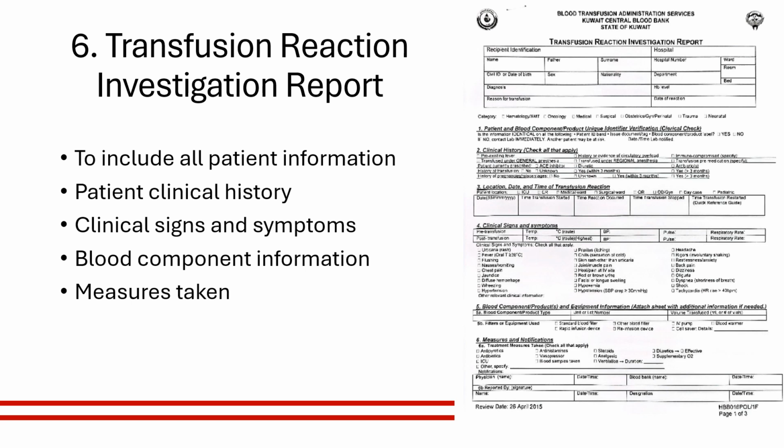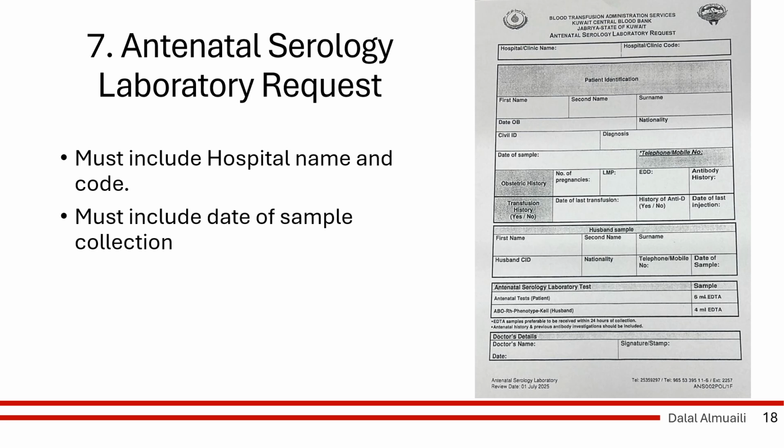And then we have the transfusion reaction investigation report. This is a report that has to be filled out every single time you either have a confirmed or even a suspected transfusion reaction episode. And we will talk about transfusion reactions, inshallah, in another one of the recordings in this series. And then we have the antenatal serology laboratory request. So this again is another form that has to be filled out for all the antenatal testing.